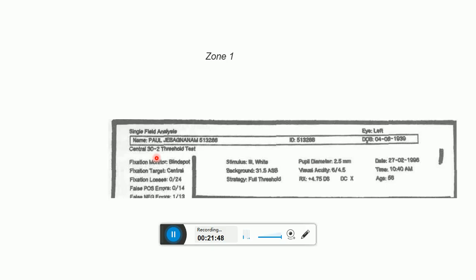Conditions requiring a complete near addition of 3 diopters include elderly individuals with an age of more than 60 years, pseudophakic or aphakic individuals, individuals with dilated pupils, and individuals with myopia of more than 3 diopters. Refractive error of even one diopter causes generalized depression in sensitivity, which may become a cause for misdiagnosis.